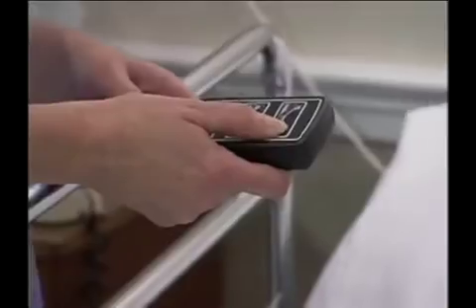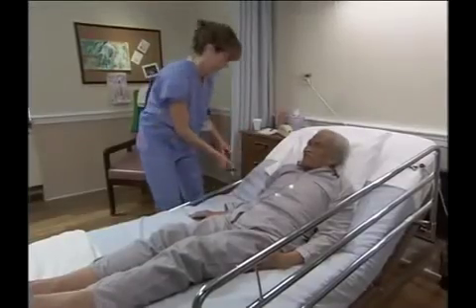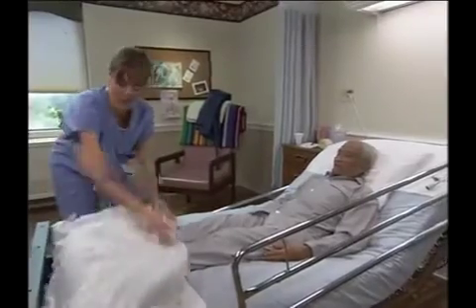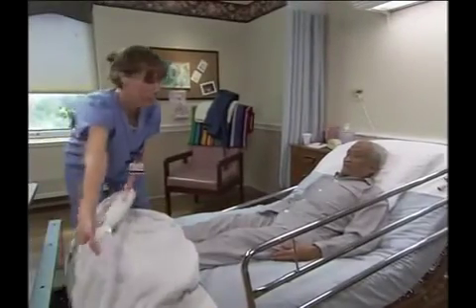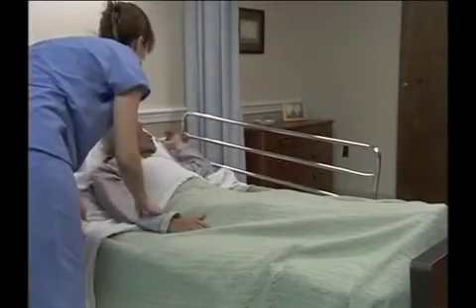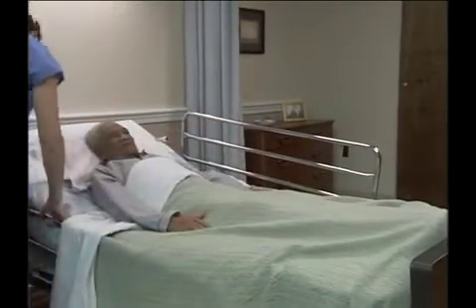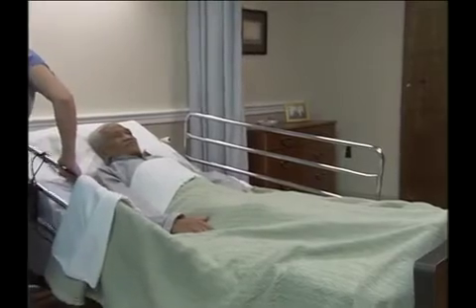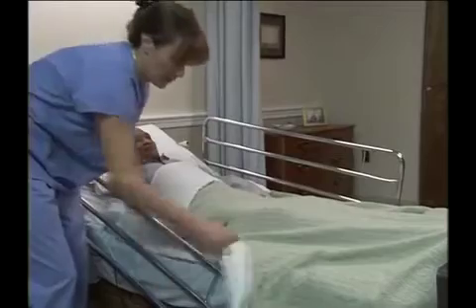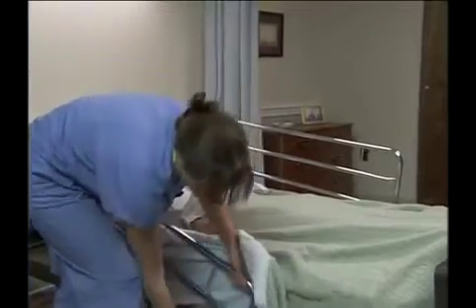Then, position the head of the bed to the level that's comfortable for the person. Straighten the bottom linens and make sure the person is comfortable and in good body alignment. Draw the top linens over the person and make sure the call light control is within reach. If the side rails are in use, return them to the raised position. Then, complete your finishing up steps as described in the final section of this video.